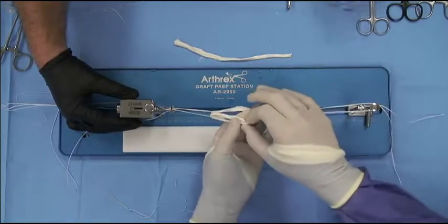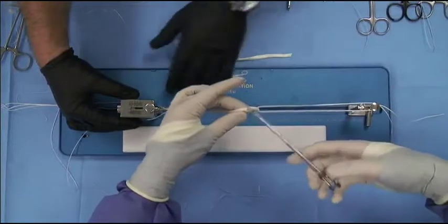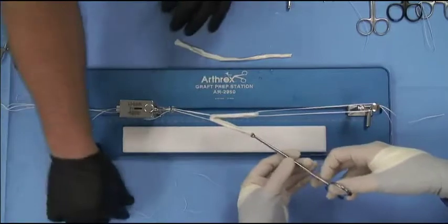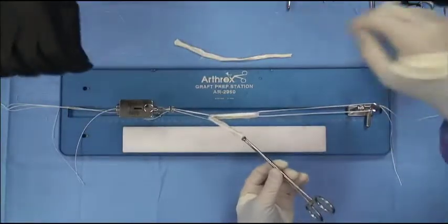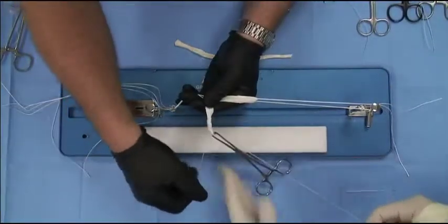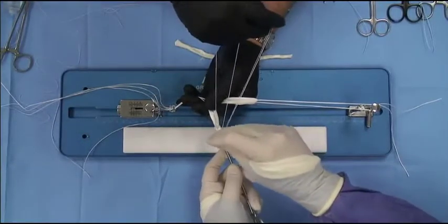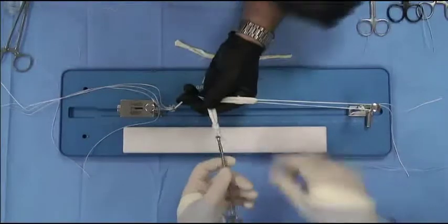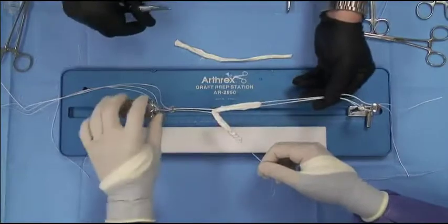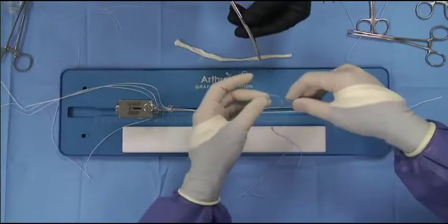And now what I'm going to do is actually pass one of the limbs through the loop so they're on the same side. You can hold these with an Allis clamp or with a hemostat, but eventually those get in the way. So the best trick is to take a fiber loop and sew them together. Take out the slack, pass the clamp through the loop, penetrate, pull it through, and now we can take off our Allis clamp, and you can see how that's nicely affixed.